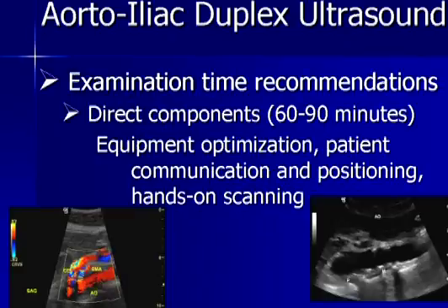As far as the time for this examination, it breaks up into 2 parts. That is the direct component of time in which you are actually dealing with the patient, optimizing equipment, acquiring data, positioning the patient, actually doing hands-on scanning, the fun part of the examination, if you will. This can take anywhere from 60 to 90 minutes.